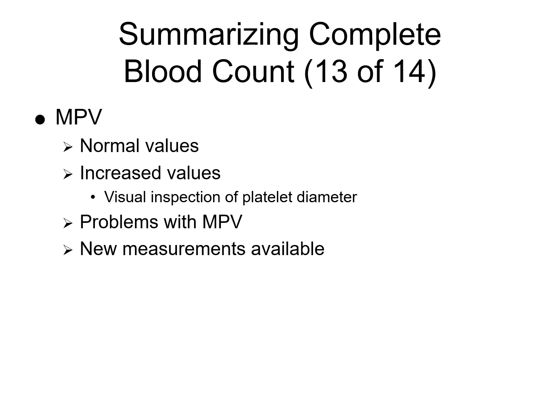We're going to do a visual inspection of the platelet diameter as well. Platelet size can be visually assessed on the peripheral blood smear, which can help confirm the automated MPV calculation. As for problems with MPV, there is variability due to different analyzer technologies. Sample handling and anticoagulants can play a role, and any time delay between sample collection and analysis can also affect it. MPV values can also be affected by platelet clumping or platelet fragmentation.